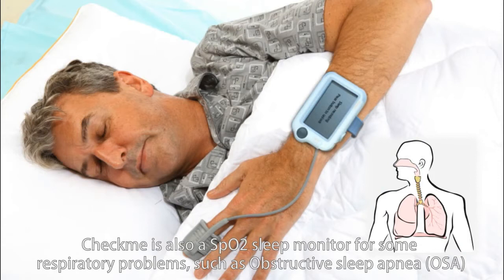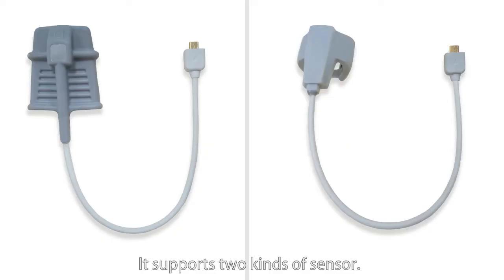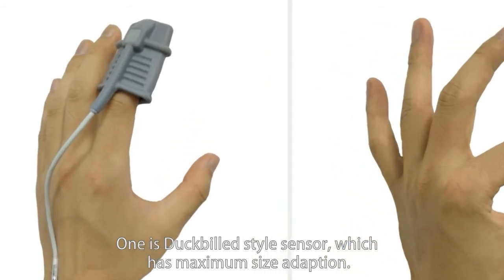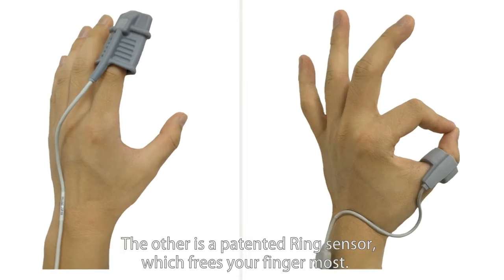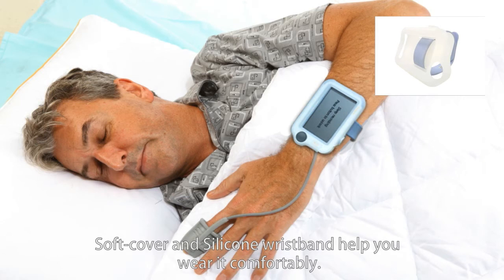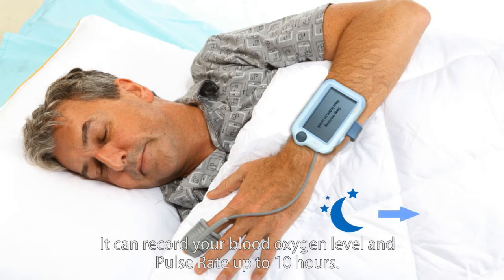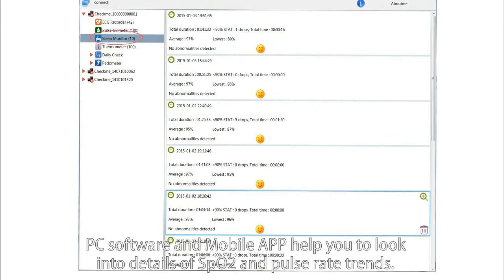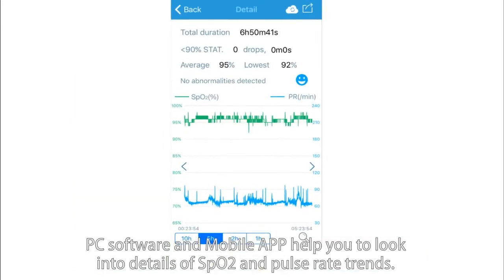CheckMe is also a SpO2 sleep monitor for respiratory problems such as obstructive sleep apnea. It supports two kinds of sensors: a duck-billed style sensor with maximum size adaption, and a patented ring sensor which frees your finger most. A soft cover and silicone wristband help you wear it comfortably. It can record blood oxygen level and pulse rate for up to 10 hours. PC software and mobile app help you look into details of SpO2 and pulse rate trends.